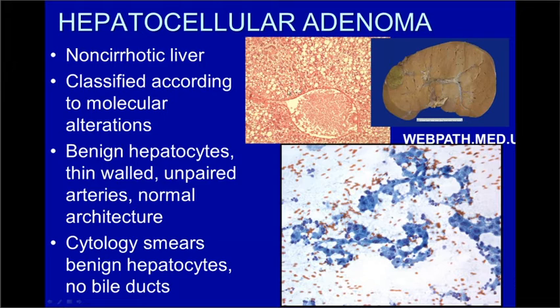When we look at histopathology, this particular adenoma shows a lot of steatosis and one prominent vessel. They're characterized by the presence of blood vessels without paired bile ducts, and these liver cell plates are only 1 to 2 cells thick. And then here's the characteristic cytology. It's really similar to the reactive hepatocytes or benign hepatocytes that we've already seen. You can see that the cells are arranged in trabeculae or in groups that are one cell to 2 cells thick. Here it lacks any significant vascularity. You can see that the cells have a low nuclear cytoplasmic ratio, and there's some variability in nuclear size. The only thing that differentiates this from the other nodules that I showed you is the absence of bile ducts, and that's the characteristic feature of adenoma.